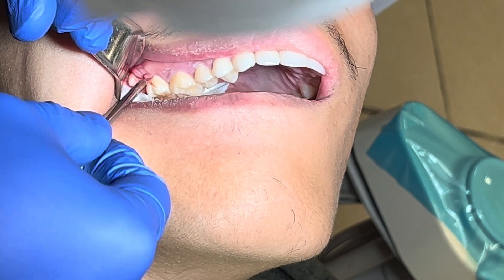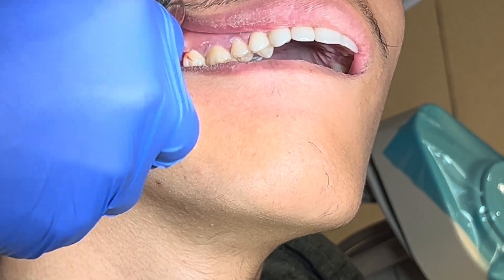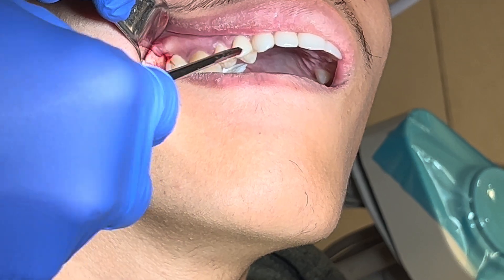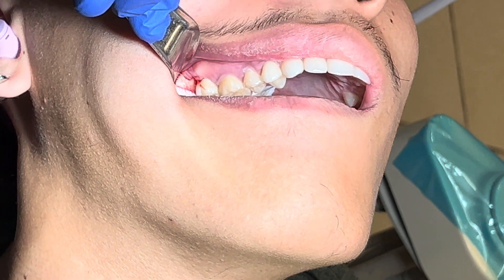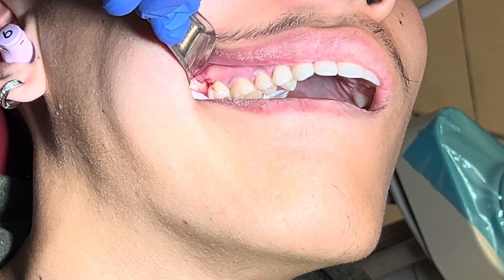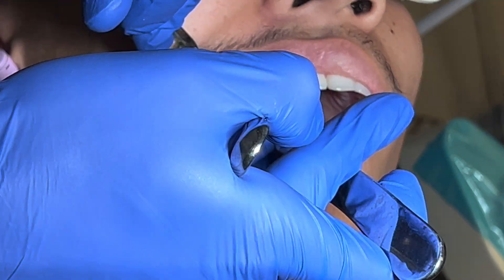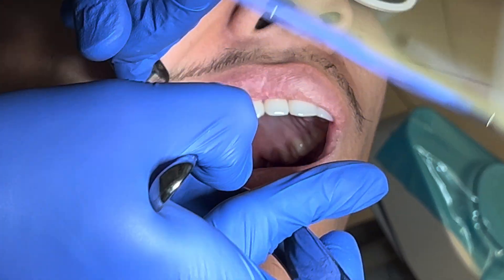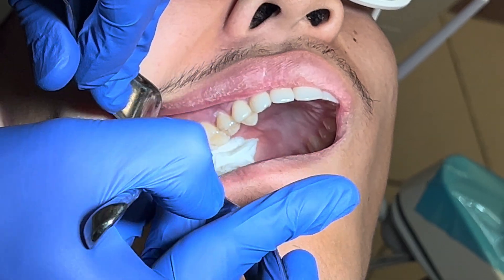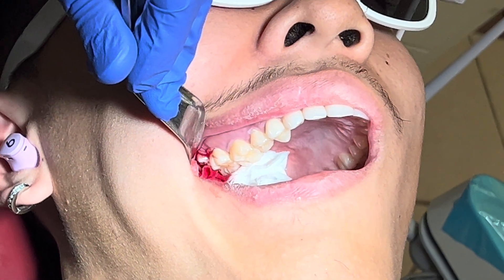Again, you can see it getting more loose. At this point you have an option — if you have a dental assistant, you can pick up with the surgical suction. Or you can simply use the 150 forceps. You go in and grab the head of the tooth — looks like it's a little stuck.